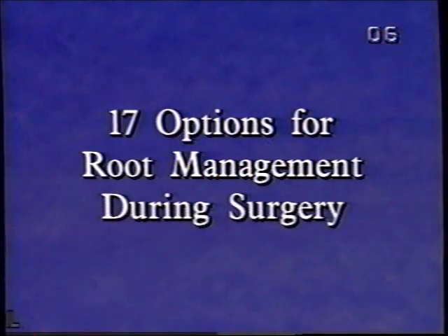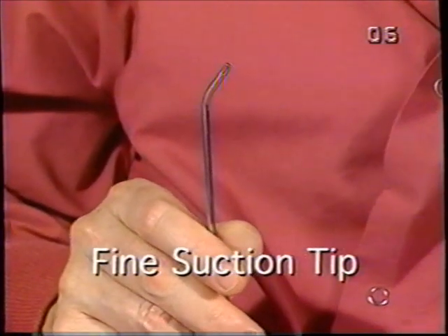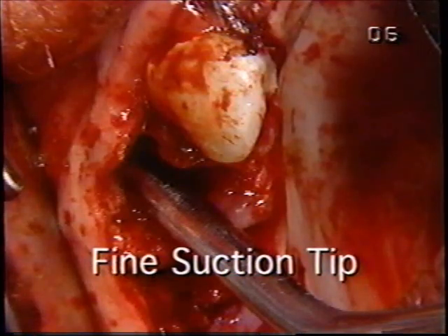There are 17 different things I'd like to mention, things that if implemented will help expedite a procedure, will increase your comfort zone, knowing that if one thing doesn't work, within a minute or two you can quickly go to something else that may do the job for you. We're talking about things such as using the fine suction tip for the upper bicuspid fractured roots, something that will enable me to see clearly to the apex of a very delicate socket.